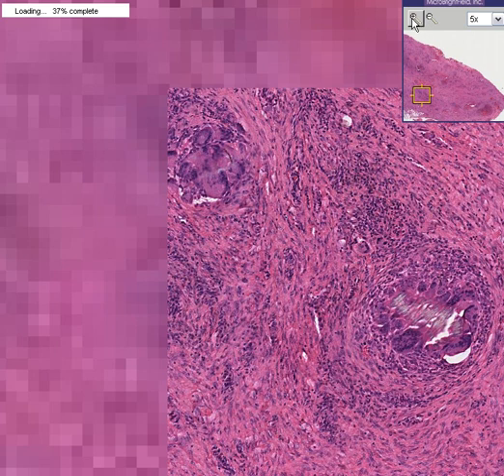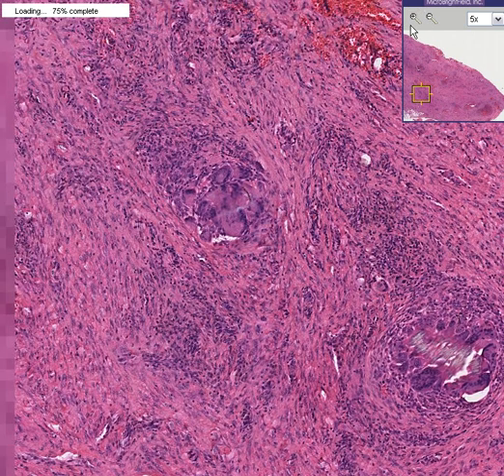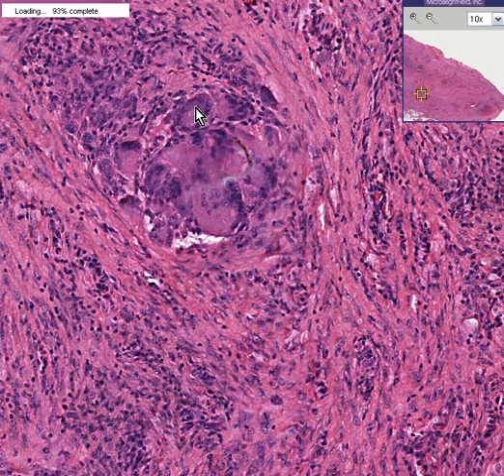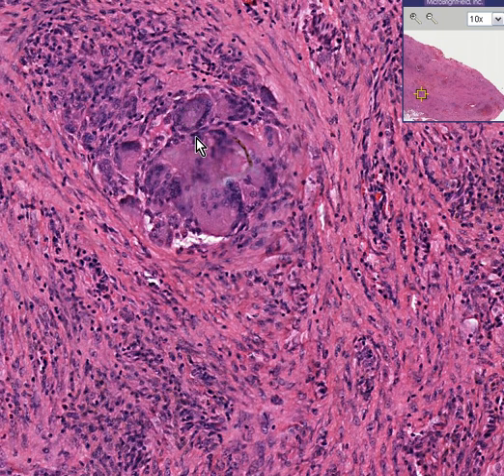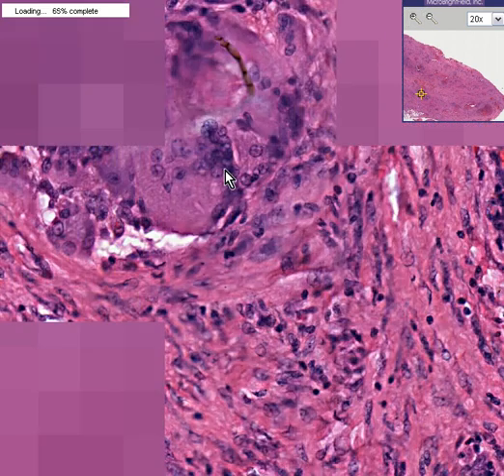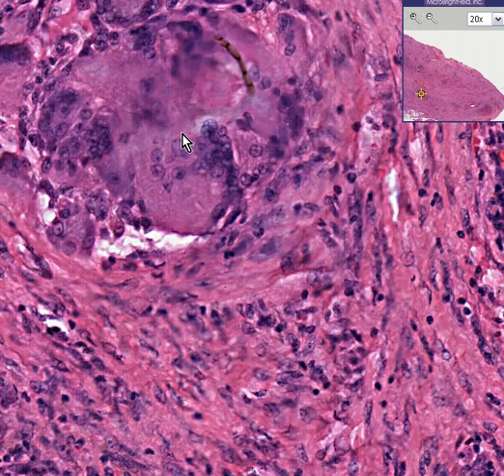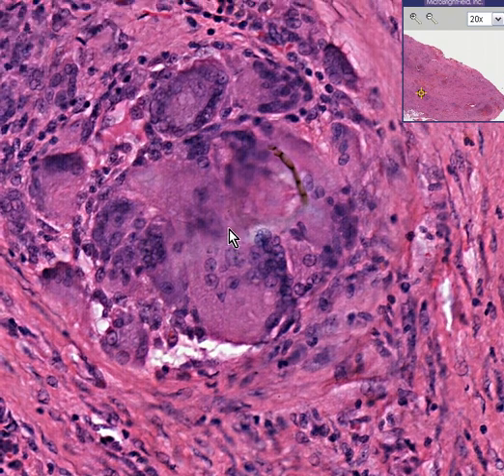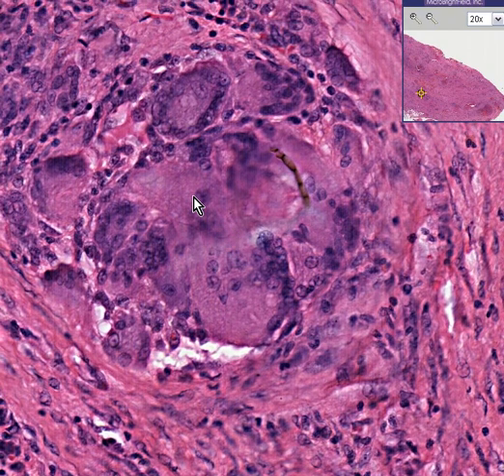And if you zoom in on some of these inflamed areas, we can see that there are these multinucleated foreign body giant cells. Multinucleated foreign body giant cells are associated with granulomas due to any cause, including foreign body granulomas.